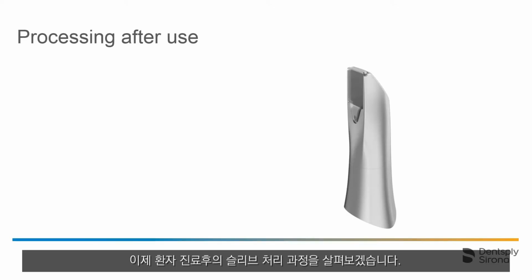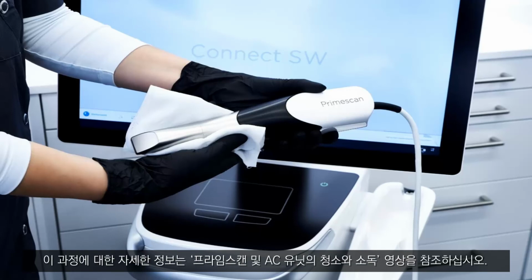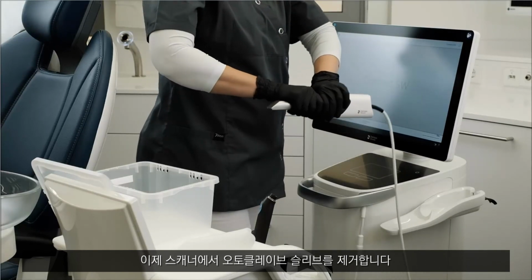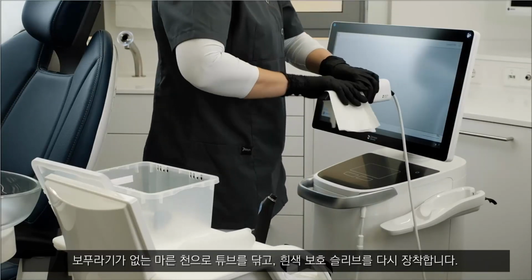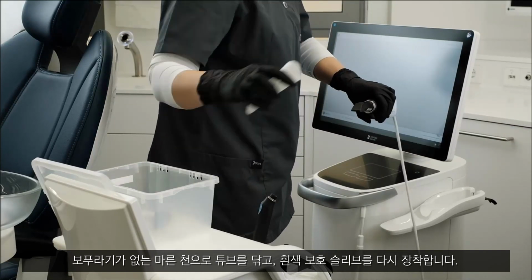Next, let's look at the steps after use inside a patient's mouth and the associated processing of the sleeve. First, perform a wipe disinfection of the acquisition center, including the scanner. For detailed information about this process, please refer to our video tutorial entitled Acquisition Center and Primescan, Cleaning and Disinfection Procedures. Now remove the autoclavable sleeve from the scanner. Wipe the tube with a lint-free dry cloth and reattach the white protective sleeve.